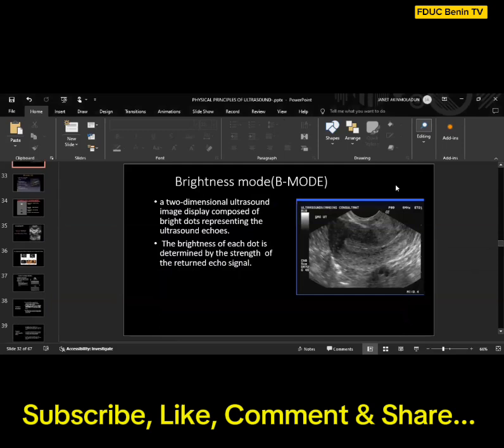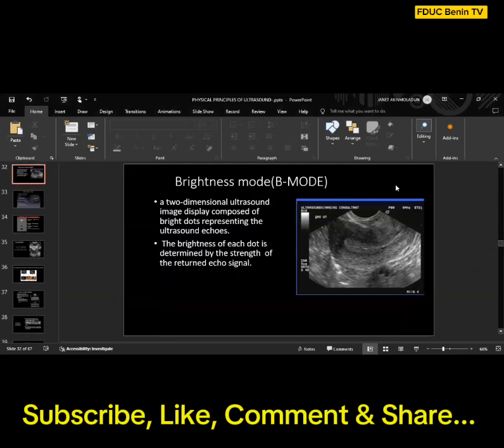Yes, I want to be clarified, because I heard her saying that Doppler is not used in early pregnancy because it produces high heat. I don't know whether I'm correct, but we have different types of Doppler: continuous wave, power, color, duplex, and pulsed wave. Are all of these the ones you should avoid, or is there a particular Doppler you should not use during early pregnancy, or all of them?